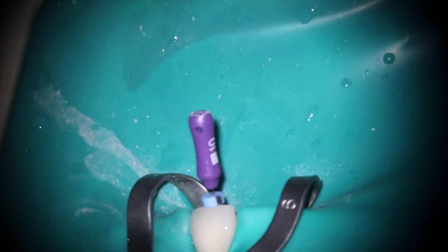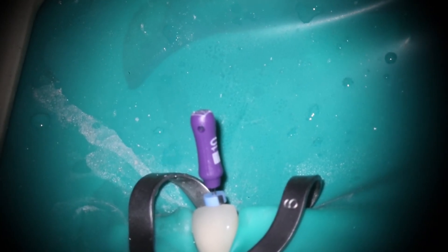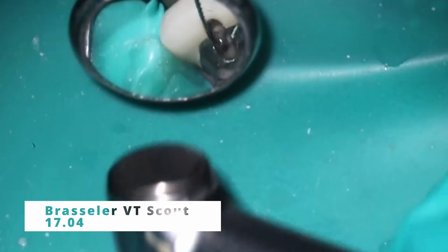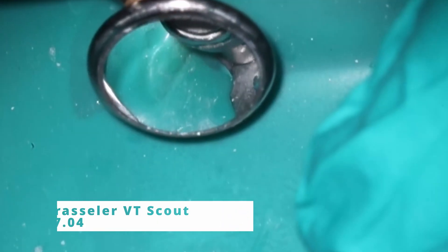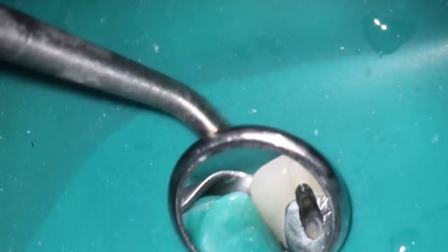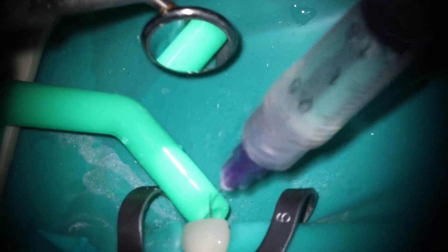In this case, I guess we could have gone even farther, but I didn't want to have to repair the porcelain — the tooth itself was fine and I was able to find everything without it. On really crazy calcified cases, sometimes it is worth it to do the access through the incisal edge or even from the facial. There are ways you can use modern composites to block it off, but on a case like this where it's more wide open, it's not really necessary.